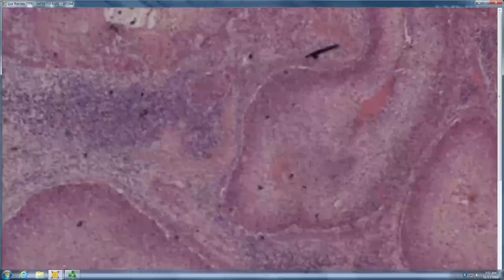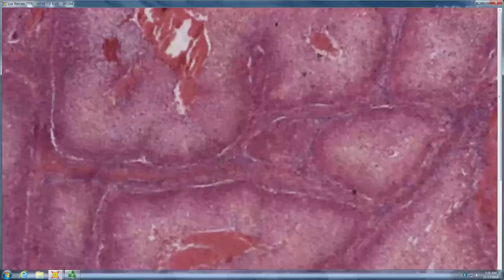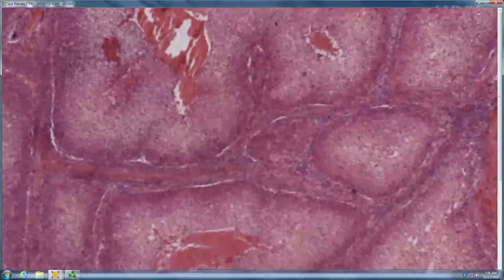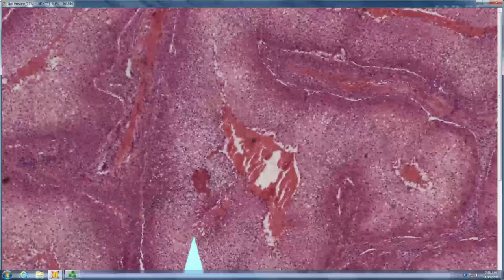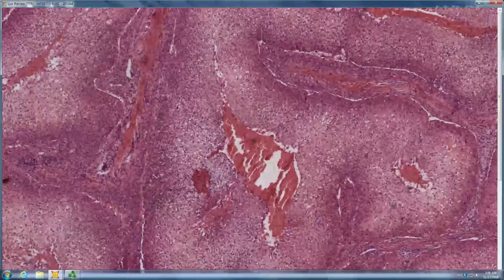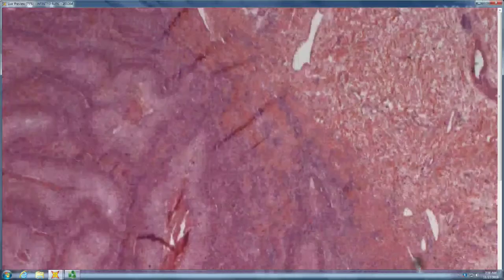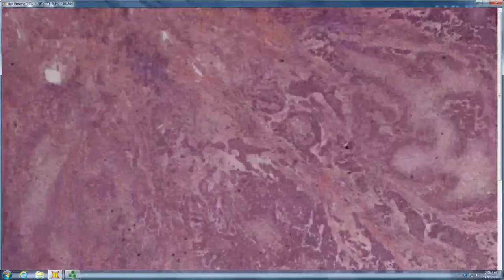So a lot of almost basaloid islands, kind of pinkish. Happy centers or necrotic centers? Maybe necrotic centers, unhappy centers. So that suggests this is not a nice friendly thing; we're dealing with some sort of malignant thing. Yeah, so definitely malignancy. And then what kind of malignancy?